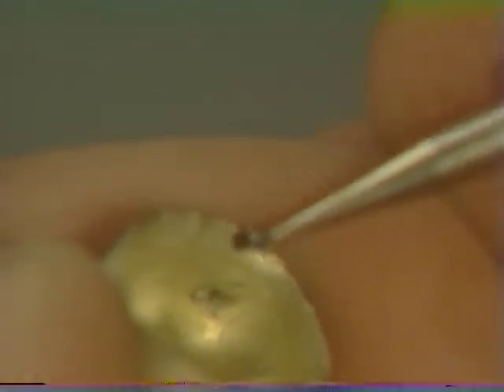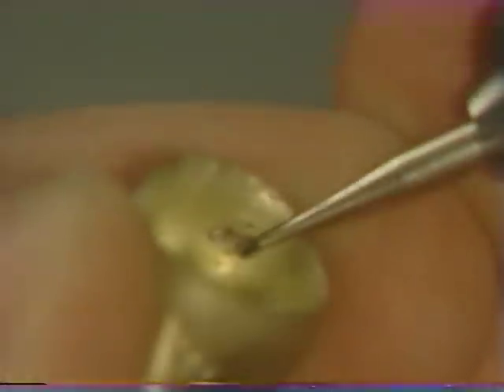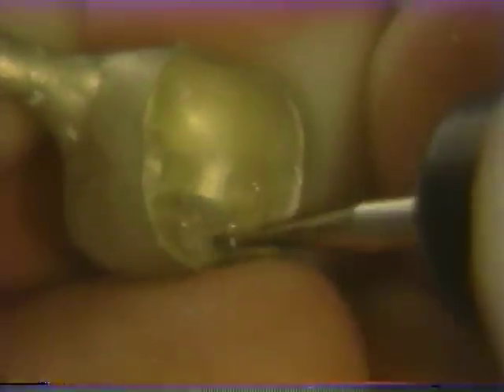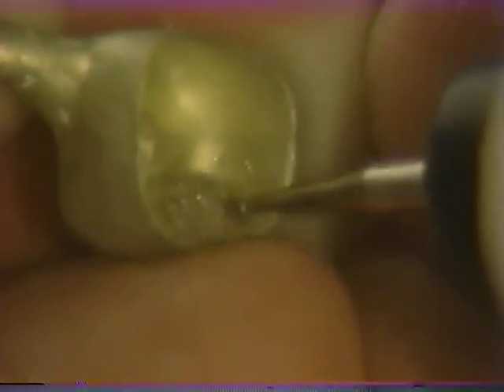You can see there is a rather big nodule which will be removed with a small round burr. Never should a casting be adjusted on the internal aspect indiscriminately — you should only grind in the area of the nodule. Whenever the internal surface is adjusted, be very careful not to damage the margins; good finger rest positioning is critical.